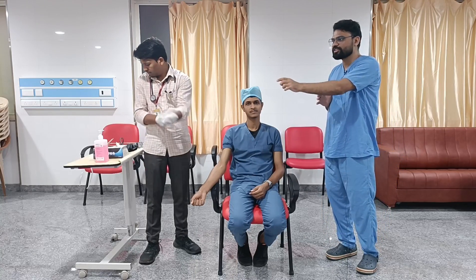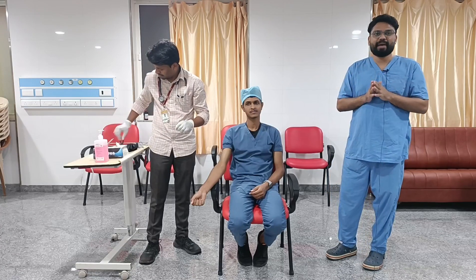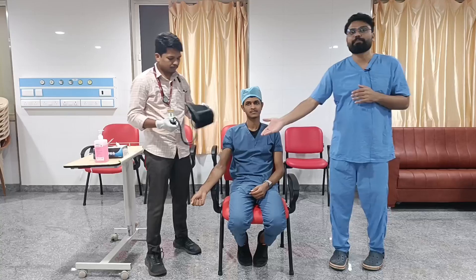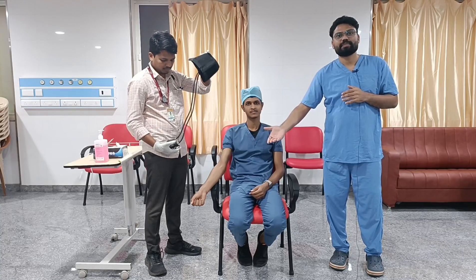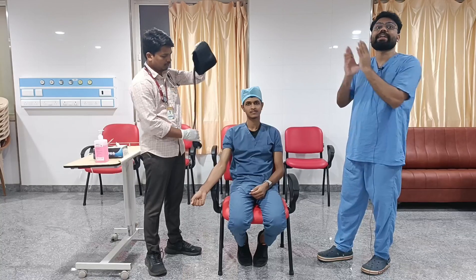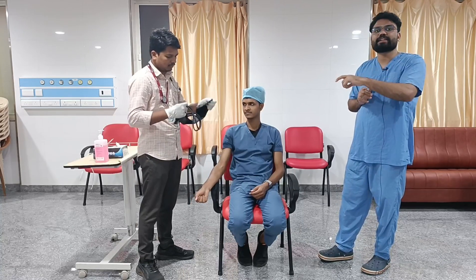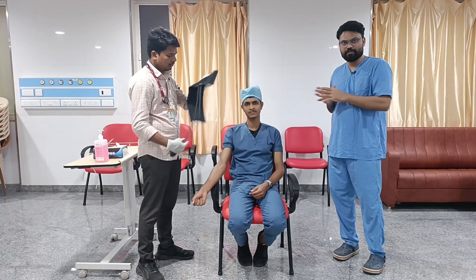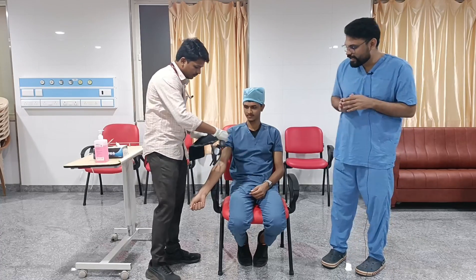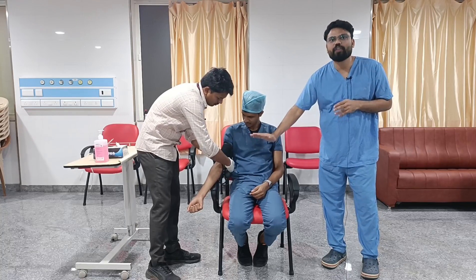To summarize the technique: hand wash and wear gloves, then support the patient's arm in resting position. Select an adequate cuff size where the bladder encircles 80% of the arm, and place the cuff such that it is at the midpoint of the sternum at the level of the right atrium.